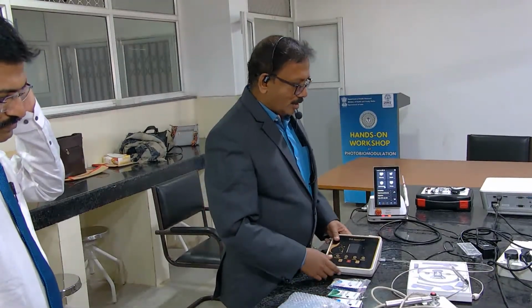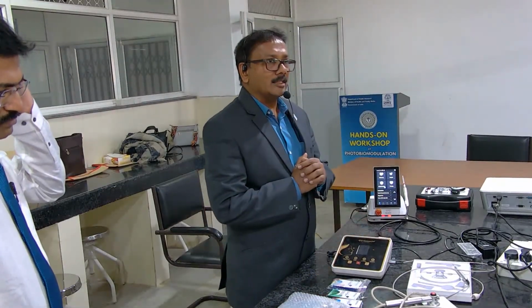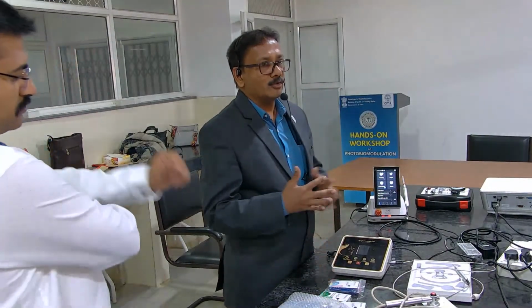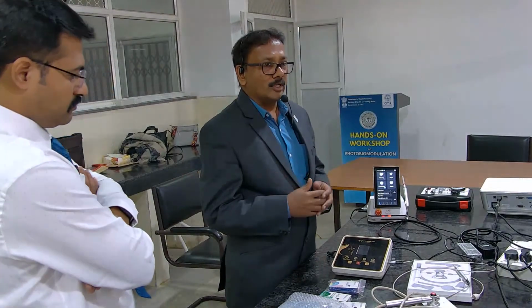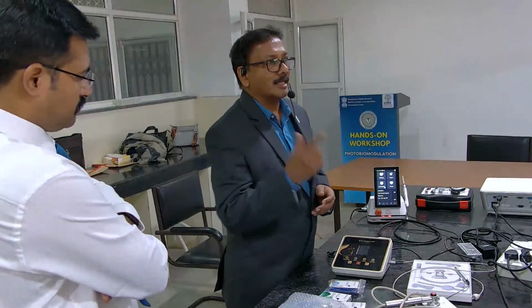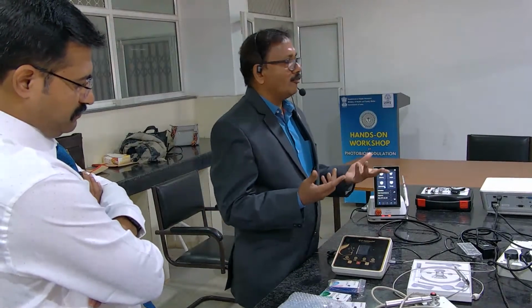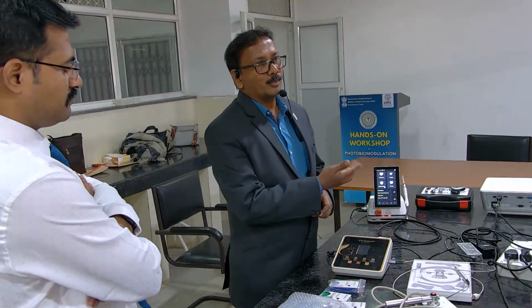So once you ask the dealers what is the wavelength of the laser, when I can use this blue, when I can use this green, then they will not be able to answer because they've been trained only to concentrate on the watts, that ours is more than theirs. A general dentist will fall into the 10 watts, theirs is 5 watt, 6 watt.